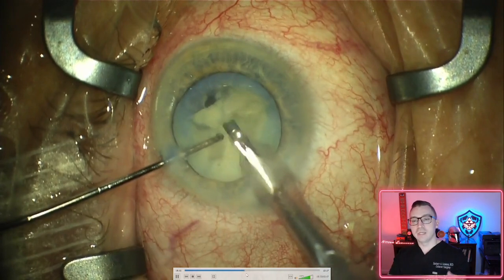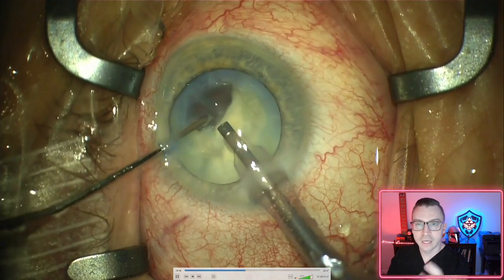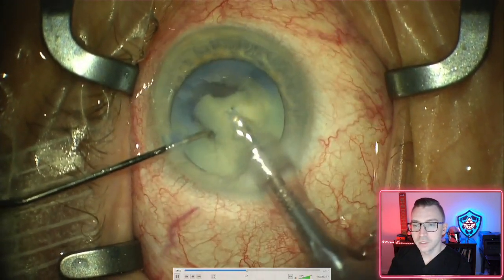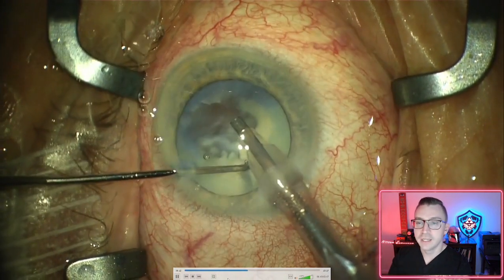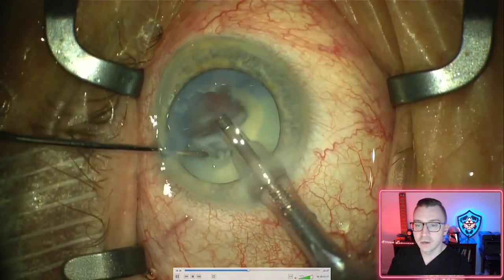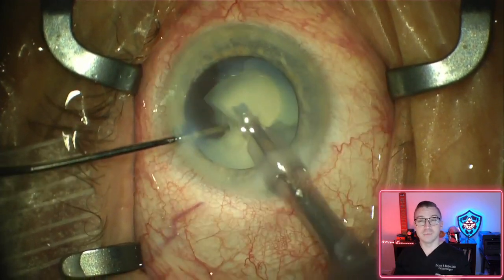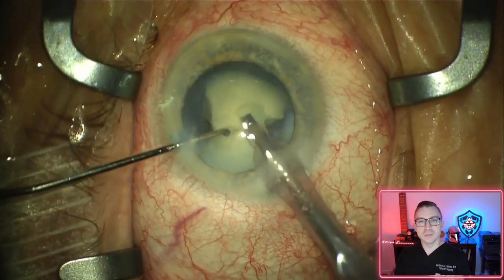Now we are actually beginning to remove that actual cataract material, and already here at my cursor, hopefully you guys can see the cursor on screen, already we can begin to see through the cataract. Here in a moment you'll get a much better view of that. Here comes quadrant number 2 coming out. This thing is actually very dense. You can't really tell it from this video, but I've got the power cranked up on my machine to get through this cataract. You can kind of see here how these really dense cataracts, instead of being kind of soft and almost gelatinous in a way, can sometimes become very brittle, and they shatter and they fragment almost like glass would. It kind of splinters like that.